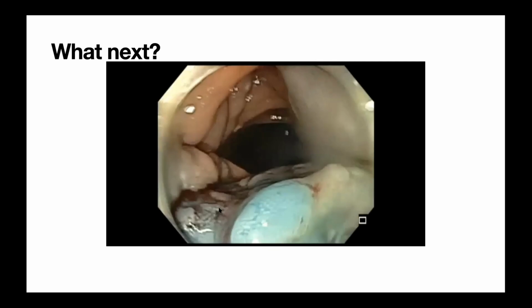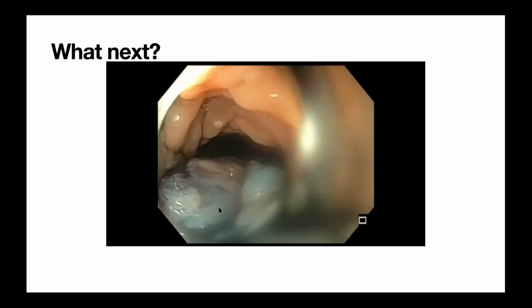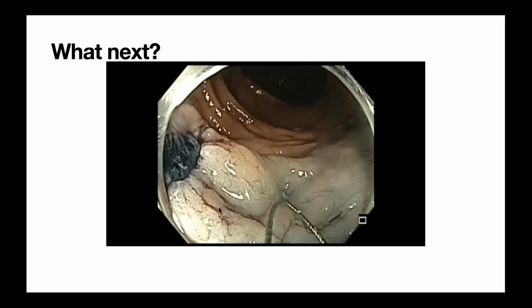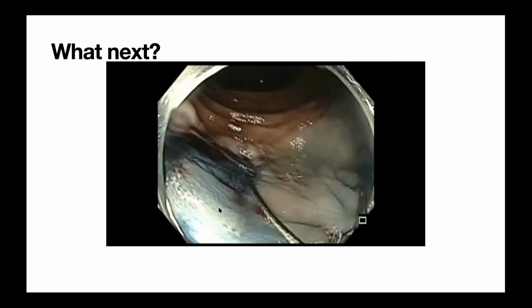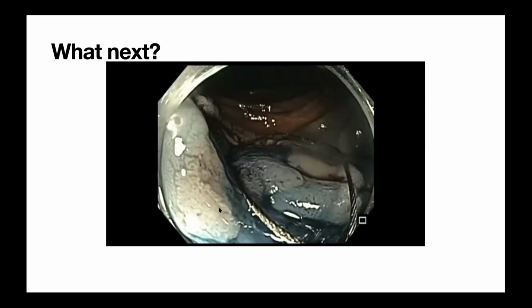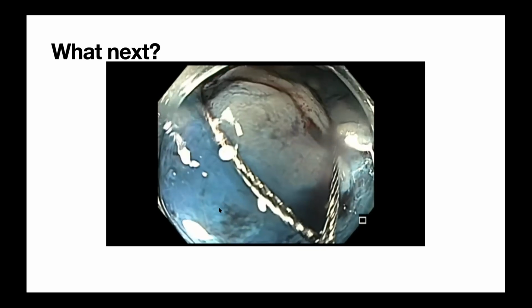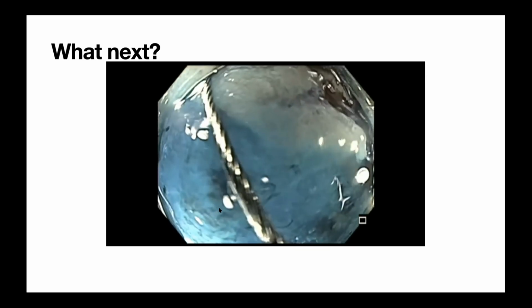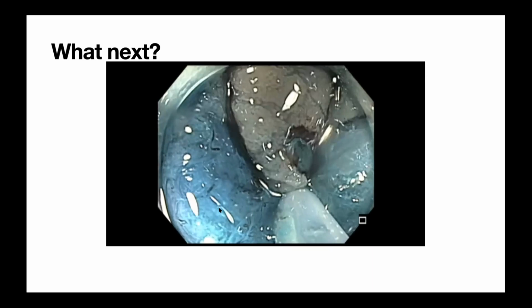he kept cold cutting that. And the cold cut was with the hard snare, the Olympus Snare Master. The cut was getting a little bit superficial, and the polyp was slipping through. So then I decided that I'm using a hot snare, but I'm ending up cutting cold. So at that point, I said, why don't we just shift to the Snare Master plus cold snare, the hot and cold snare, and then decide to do this resection as a cold EMR.